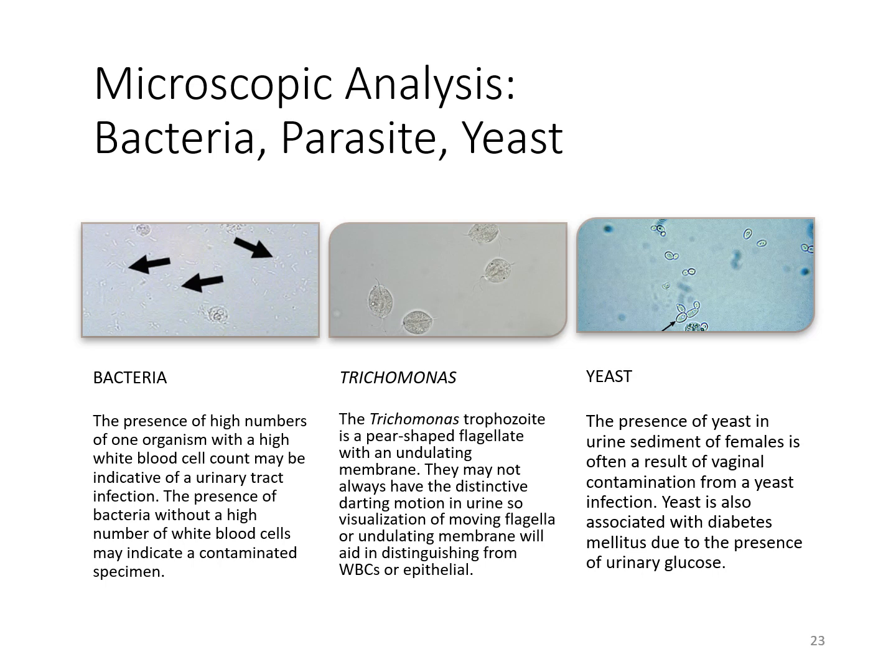Trichomonas would be an example of a parasite. This little parasite is sexually transmitted, and you can recognize it because it is a flagellate, so it actually moves around with flagella, so you can see it moving around in the urine, especially if it's a fresh urine. If it's a little bit older, it's kind of hard to tell the difference between trichomonas and a white blood cell, but as you get more experience, you will get used to that.